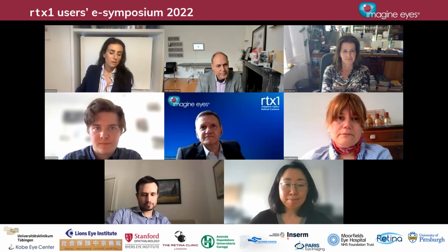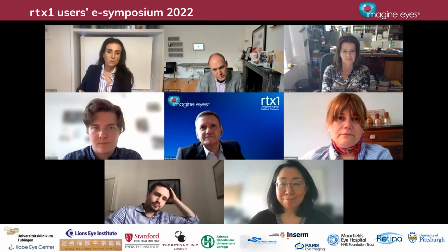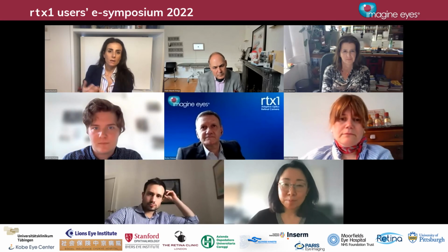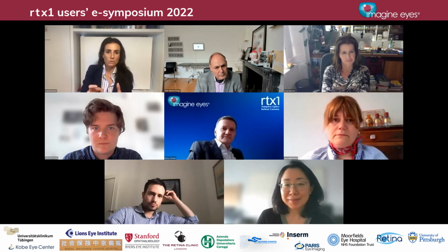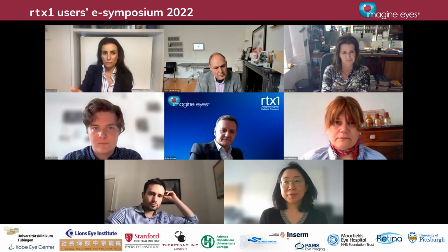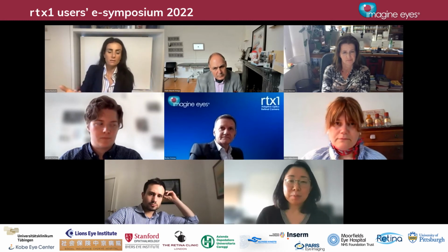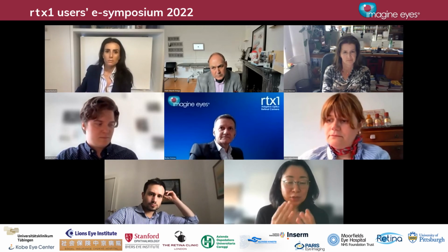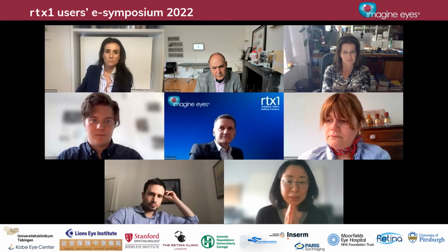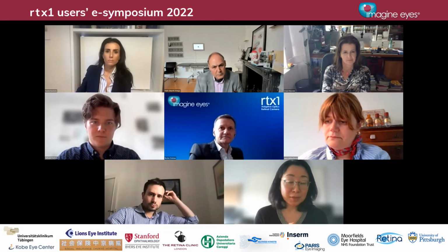Sorry, do you think, Kyoko, that these hyperreflective dots could be agglomerates of puffy cones? Because we see these hyperreflective alterations in a lot of diseases, also in inflammatory disease. Because I think it's another thing. What I see, the structure, it looks different. The photoreceptor itself, or maybe the RPE or something, is different.